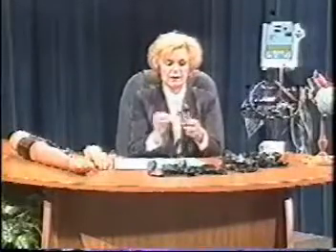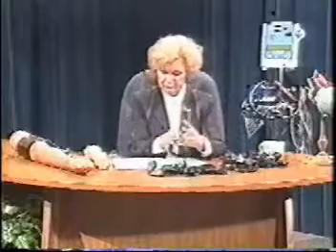The other important thing to remember is you must always clean with an antiseptic wipe. I'll start with the diaphragm and the bell first. They're probably less dirty. Clean those areas off, and then clean the earpieces off using another part of the antiseptic wipe before and after using them on your patient.